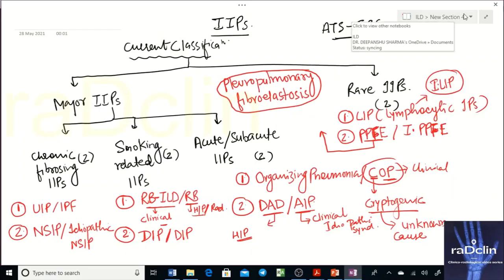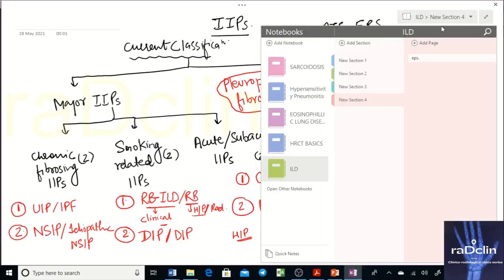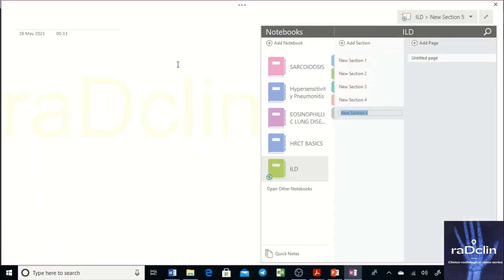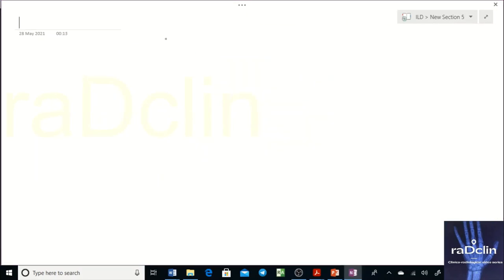We are now entering into the radiology section and we'll discuss each and every pattern one by one. The first pattern we're going to discuss is about the UIP. More importantly, you need to know what is expected from the radiologist and how we proceed with the scan.